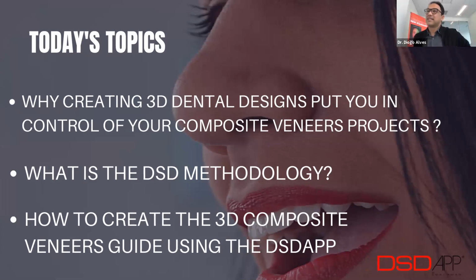So let's dive into it, right? Today, we are going to be talking about why creating 3D dental design puts you in control of your composite veneer projects. What is the DSD methodology? And it's very important. And how you can create a 3D composite veneers guide using the DSD app.